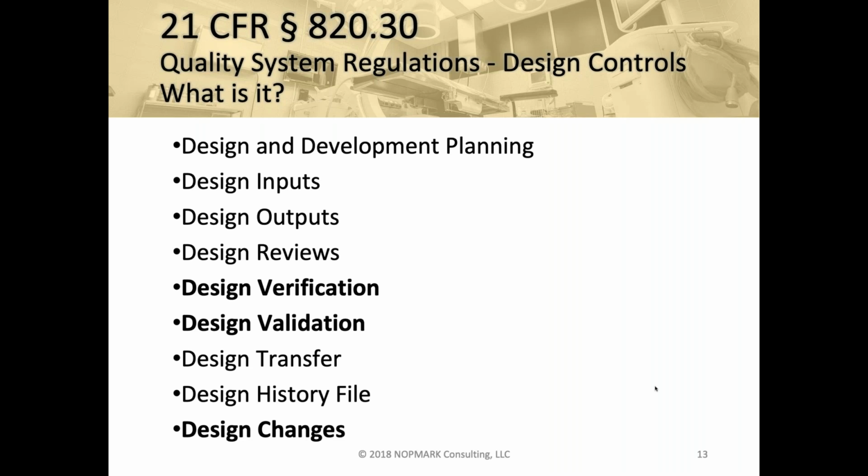And design changes is a big aspect of software life. So these are, when there's a change to the software, what's the impact assessment we're doing? What's the regression testing we're doing? What's the retesting that we're doing? So anytime there's a change, that evidence of the impact assessment and the retesting or re-verification, that kind of lives under this item of design changes.